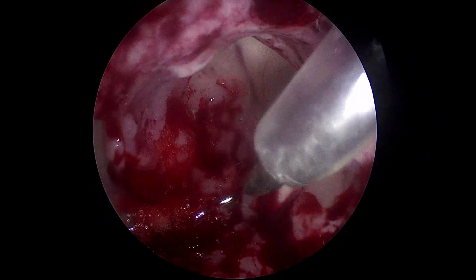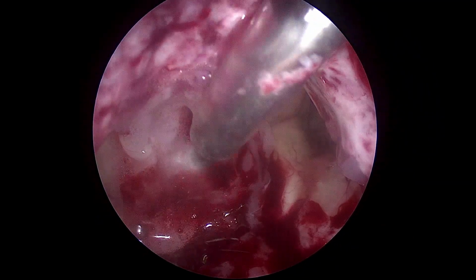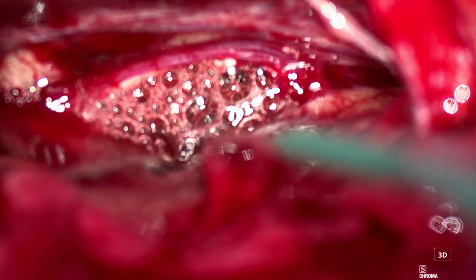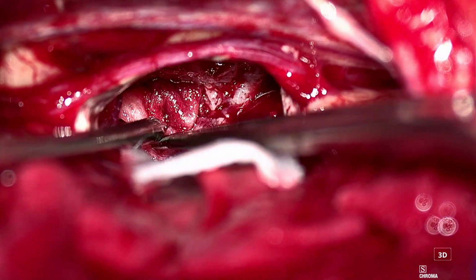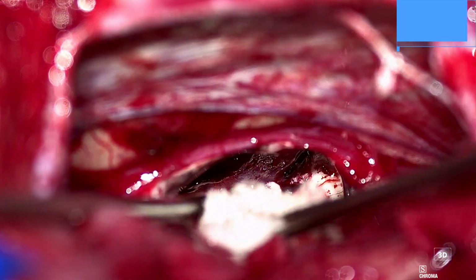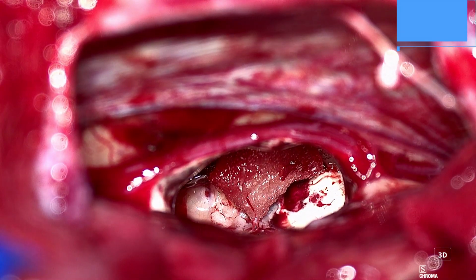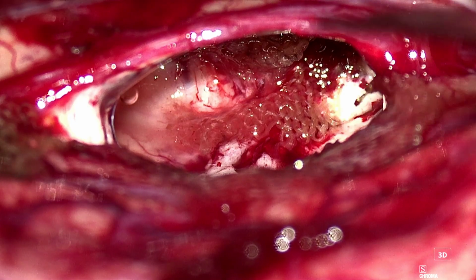After resection, a check endoscopy was performed to identify any hidden bits of the tumor, which were then removed with the help of the endoscope. Finally, after a thorough wash and achieving hemostasis, the tumor bed was found to be clear. This is the final tumor cavity.